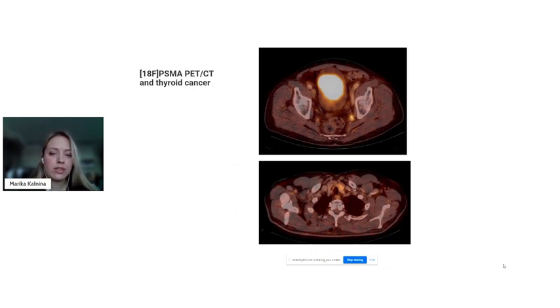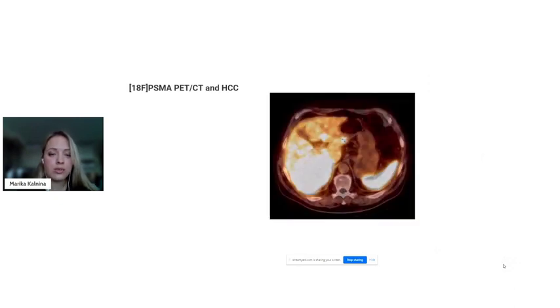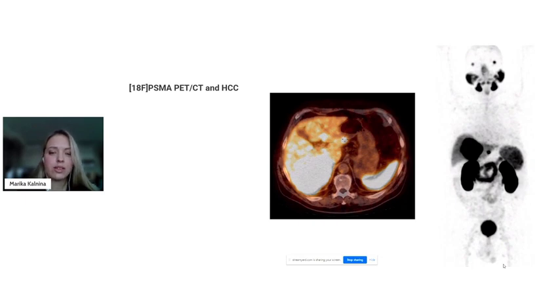We found prostate cancer recurrence in lymph node, but we also found a thyroid cancer that was treated after our exam. And another patient, we didn't find prostate cancer recurrence, but we found hepatocellular carcinoma that the patient didn't know previously.